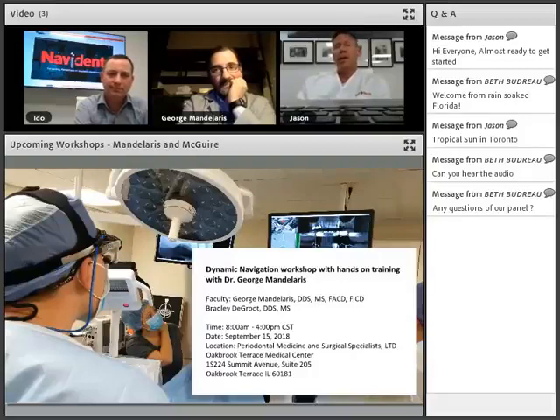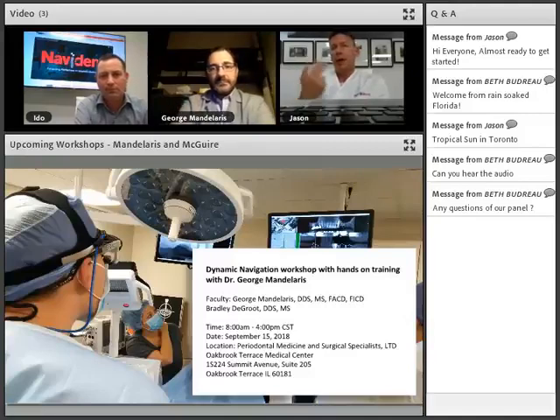If you're placing 1 implant, you pick 3 points very close to that implant area, trace those, and you're all set. If you're doing 7 implants and they're spread out around the entire arch, then we would probably encourage you to pick 4 or 5 points. But the beauty of it is you can do 3, check your accuracy check. If you're not happy with it, you can do 4. And certainly if you're placing that many implants, you're probably willing to take the time to ensure that everything's going to be perfect for the patient.